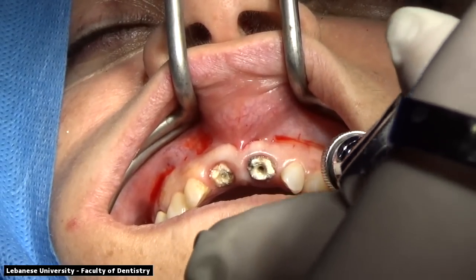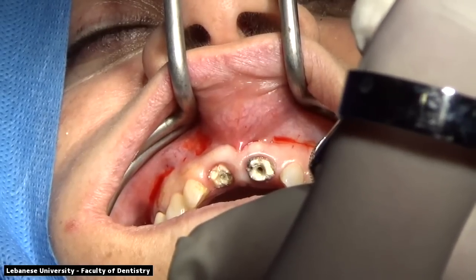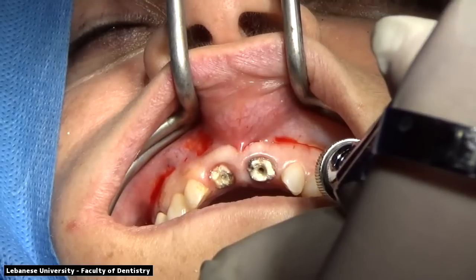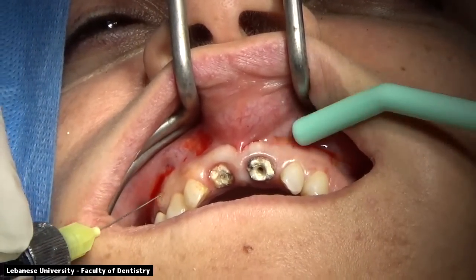We are going to be atraumatically removing both central incisor remaining roots and placing the implants at the same time, so immediate extraction, immediate implantation. The teeth will not be an immediate function. They will be restored with temporary restorations.